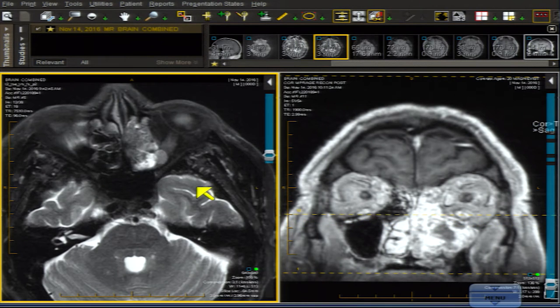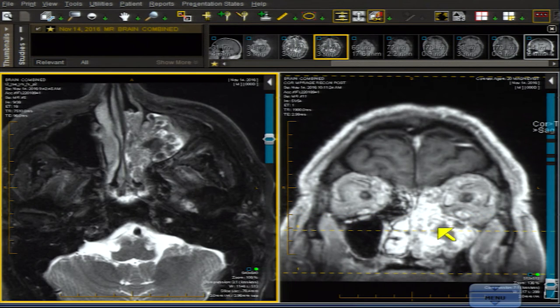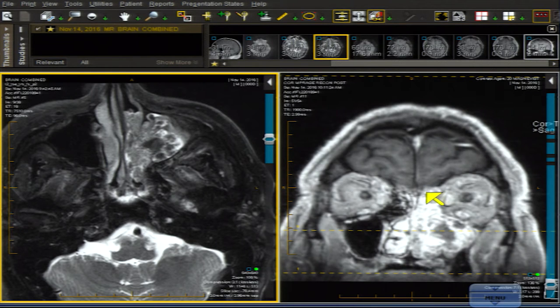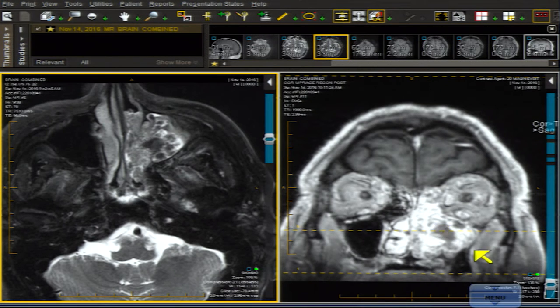Some checklist high points: check whether it invades the foramen ovale, which we don't have time to show in this vignette. Also look at the floor of the orbit, which is not invaded in this case, and the floor of the anterior cranial fossa, which is intimately involved here. Inverting papillomas tend to be epicentered right over the uncinate process because they start in the nasal cavity along the lateral mucosa, not in the maxillary antrum where 85% of squamous cell carcinomas are found.